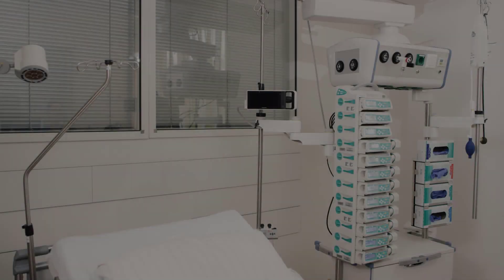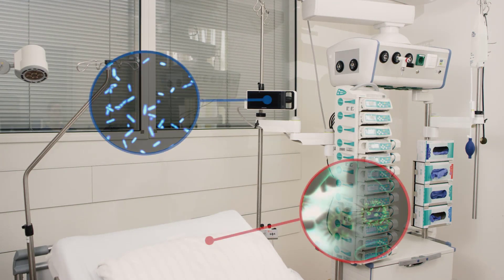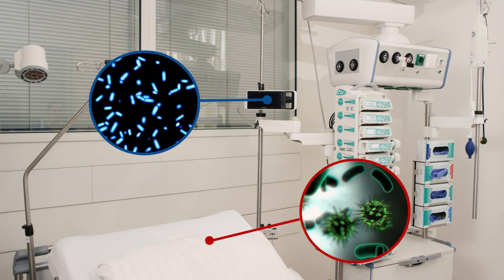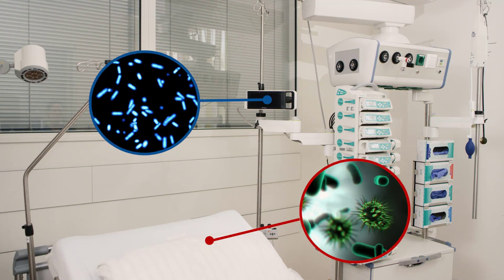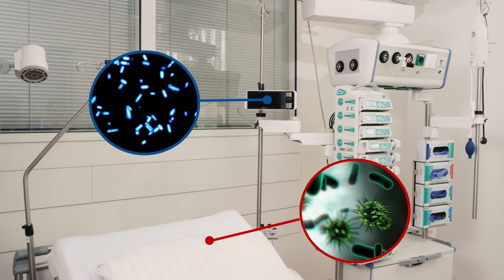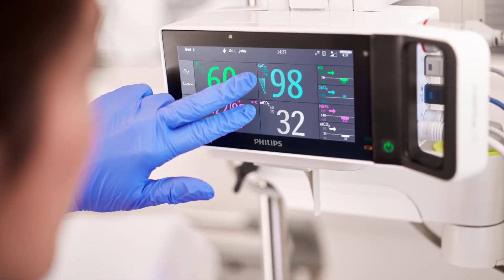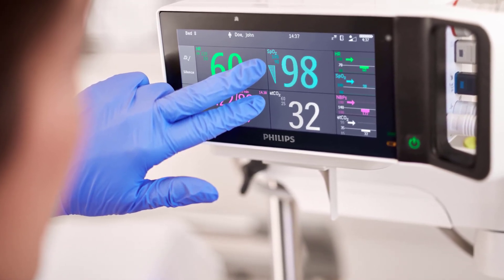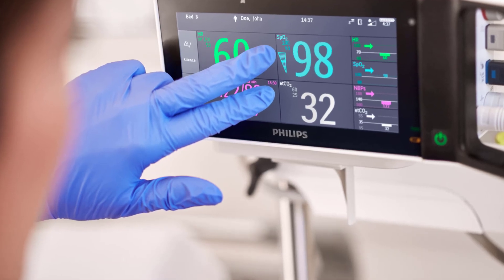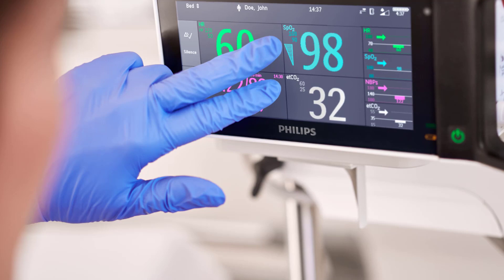When monitoring a patient with COVID-19, it is inevitable that the monitoring equipment and patient sensors and cables are in direct contact with the patient. Therefore, consider the monitoring equipment in use for your patient as contaminated. Our Intelliview patient monitors use the touchscreen as primary input device. The touchscreens are designed to work while wearing medical gloves, which is an essential part of your personal protective equipment.